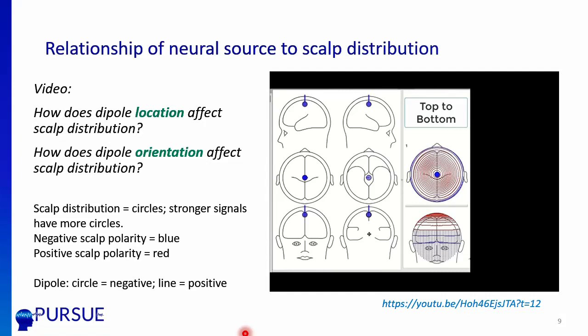So here it is going from the top to the bottom, so the dipole is getting deeper in the brain. And here the dipole is moving left to right.